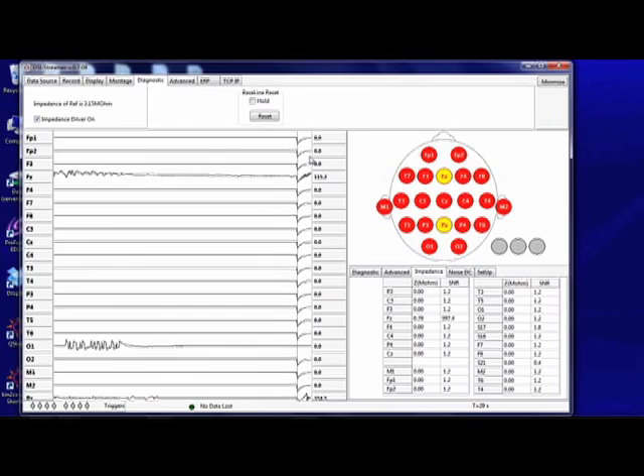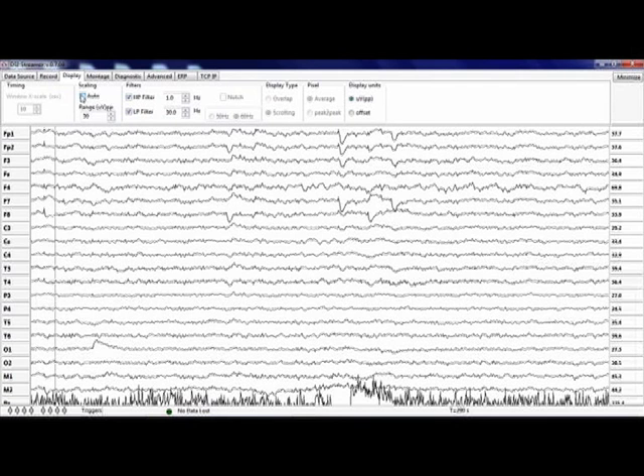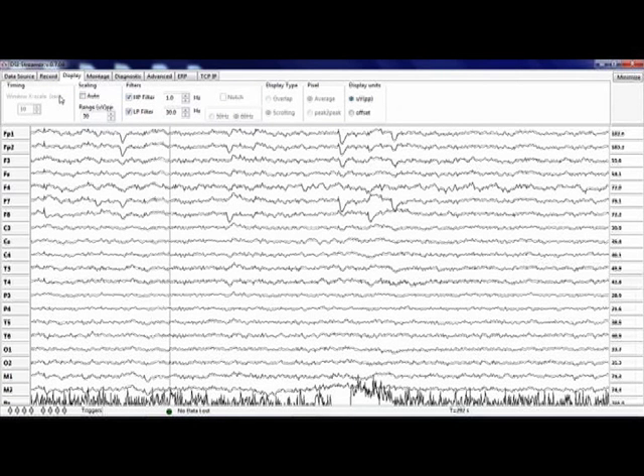Typically, in under a minute, all sensors should turn green and you are ready to record. Go to the Display tab to adjust your display settings.